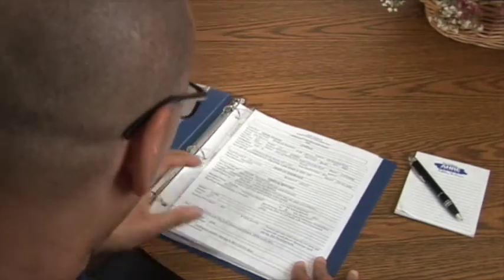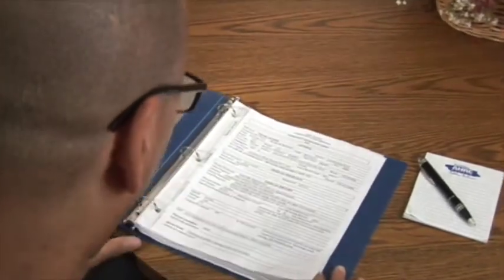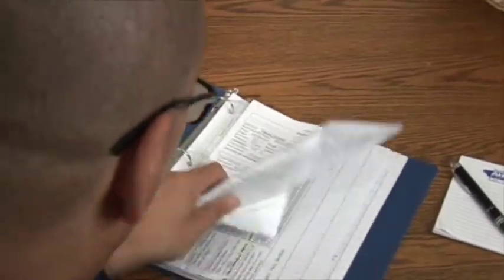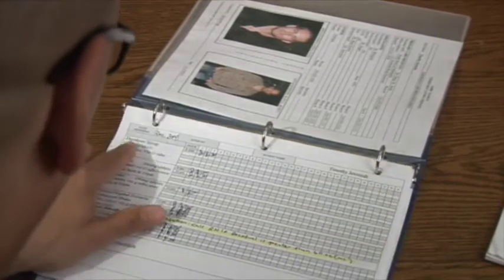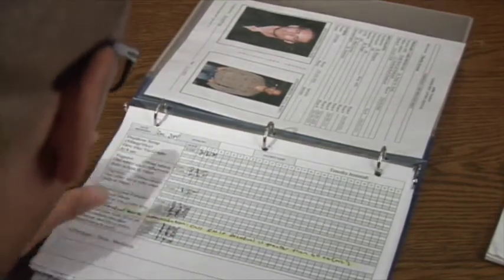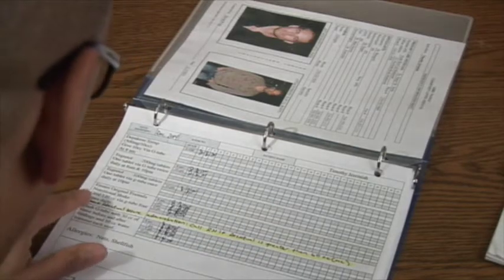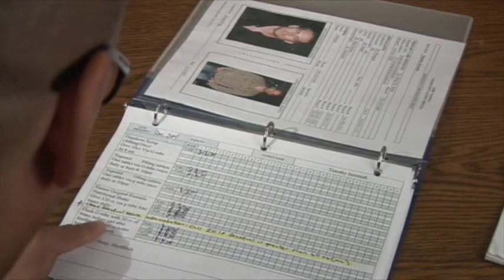I need to determine what medications and any meals I need to give via G-tube for Timothy Jeremiah. Timothy Jeremiah gets Depakene Syrup at 8, Tegretol 200 at 8 — he's not getting that one. And for meals: Ensure and Flush with Water.